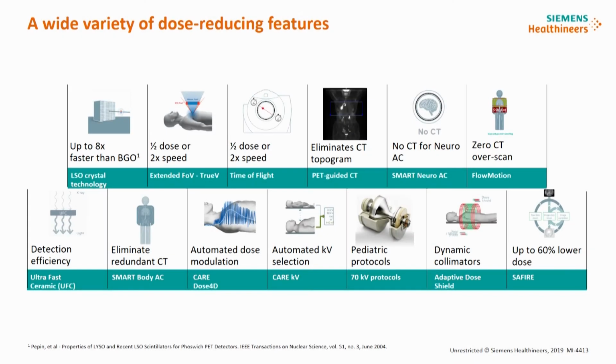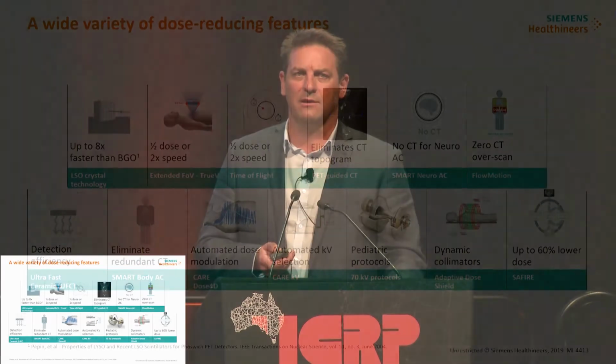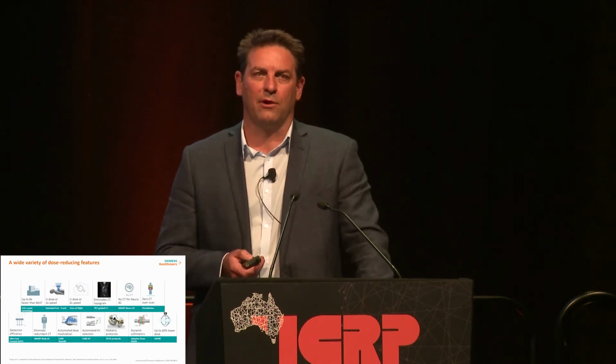So to go into a few of the features that have actually contributed to potential dose reduction, in the top line there you'll see many of the technological advancements that are specifically related to the PET side, and then I'll talk a little bit more later on about some of the CT advancements.